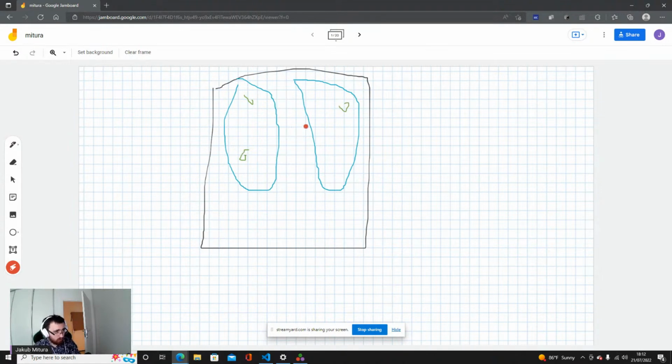For example, if you used mean squared error, MSE, or any other classical metric, the algorithm would usually converge just to a very simple thing: that all voxels are background, because this would be very simple.